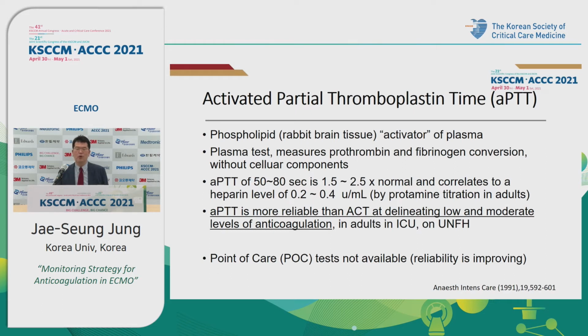APTT is more reliable than ACT at reflecting low and moderate levels of anticoagulation. A POC test is not available yet, but it is improving now.